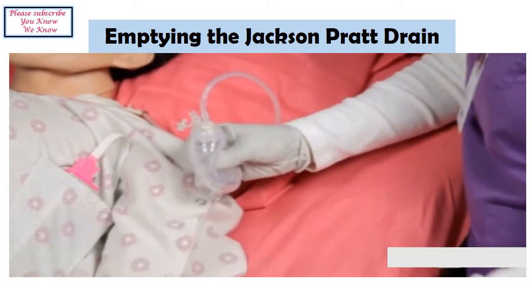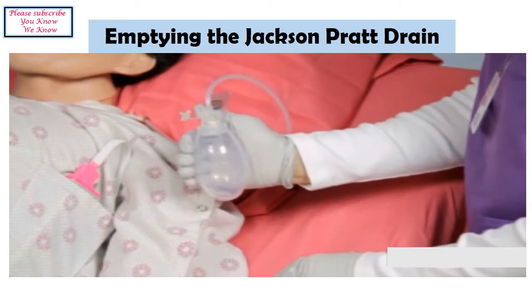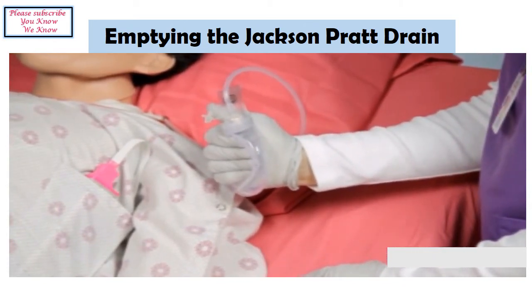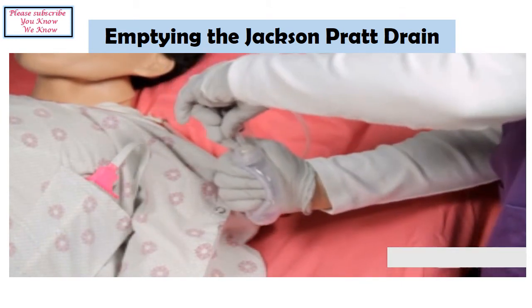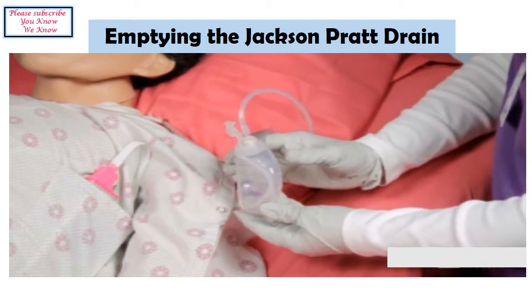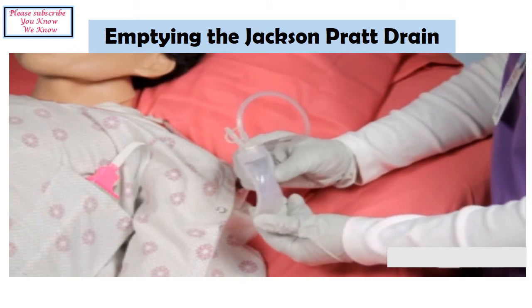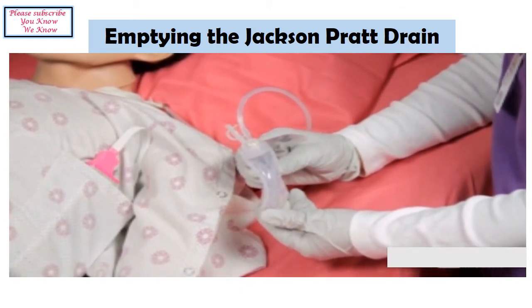To re-establish the suction pressure, first squeeze the bulb in the palm of the hand until the inside walls of the bulb touch. While maintaining pressure, place the plug and close it tightly. Slowly release the grip to re-establish suction. The bulb should remain concave or somewhat flat. It should not be fully inflated. If the bulb is not flat, suction is not being maintained.